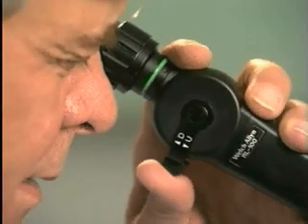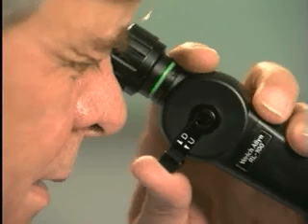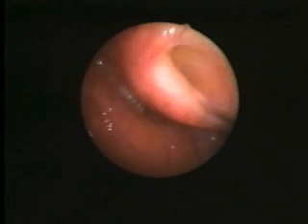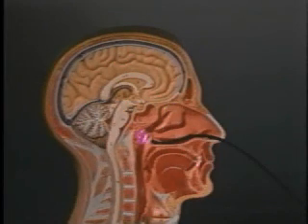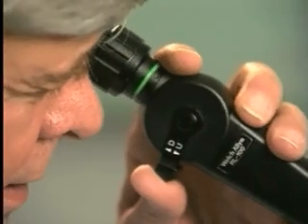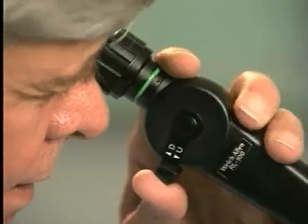Return the scope to the floor of the right nasal cavity and advance it slightly forward while rotating counterclockwise to allow for a thorough inspection of the eustachian tube opening and the torus tubarius on the same side of the pharynx. After returning the tip to the floor of the nasal cavity, the contralateral torus can be visualized by rotating the insertion tube 90 degrees toward the opposite nasal cavity while deflecting the tip in the downward direction. Returning the tip to a neutral position and deflecting it slightly superiorly, you can view the nasopharynx and in children the adenoidal pad.